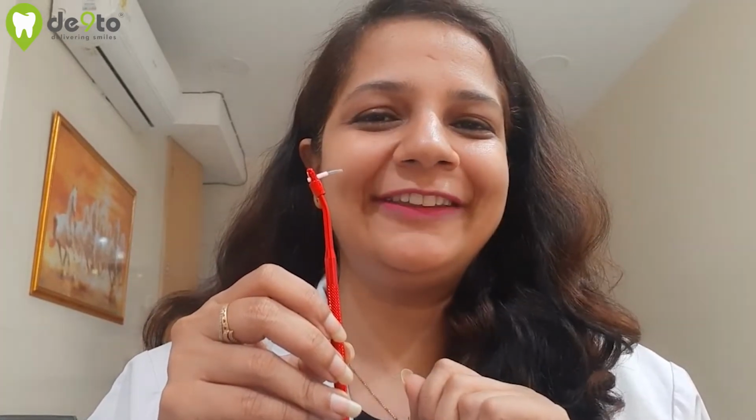And if you are still not happy with the choices that I gave you to clean the teeth and think they are all tacky and old, and say show me something new, then I have the right option for you. The latest devices to clean the interdental space are oral irrigators. They are devices in which water is filled in a can, and with the help of a water jet, the spaces in between your teeth are cleaned. They have various modes and various types of settings to help you.